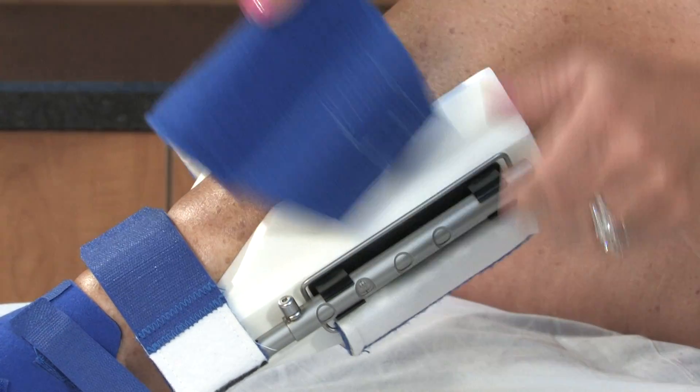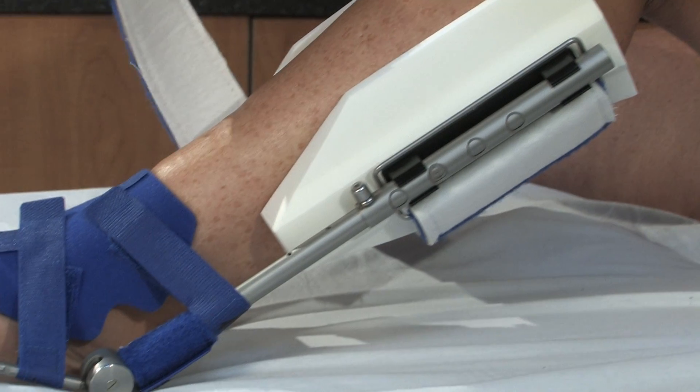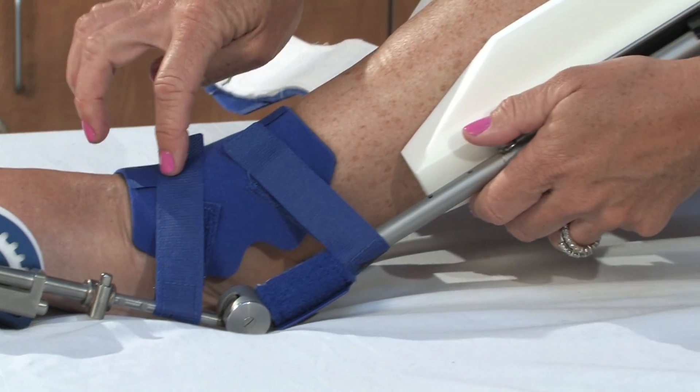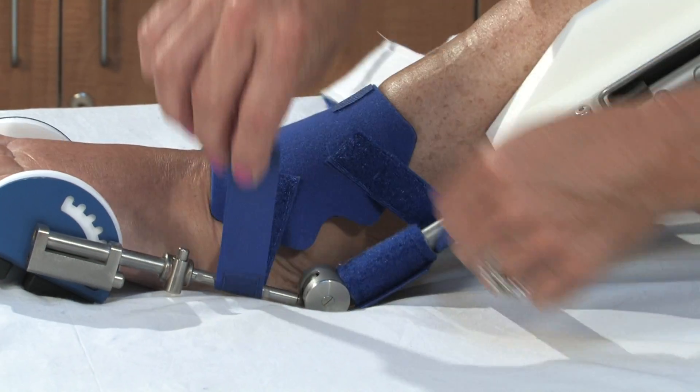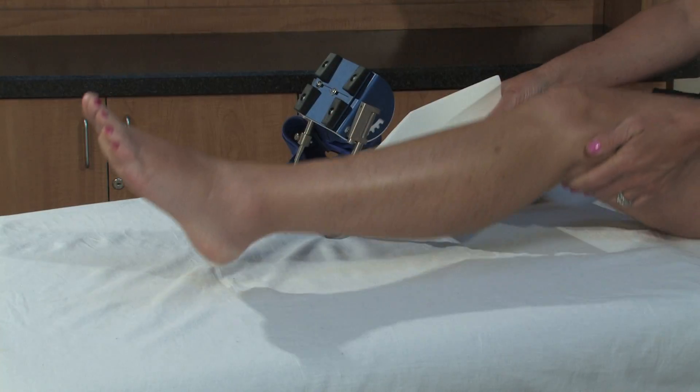In order to remove your AFD, unfasten the shin cuff, the two-inch strap, and two one-inch straps on the butterfly cuff. Now, simply raise your leg and remove the DynaSplint.